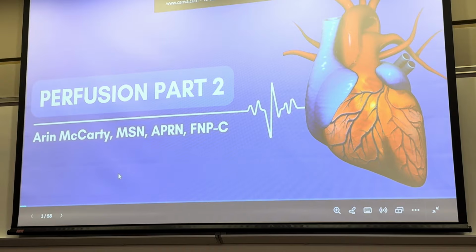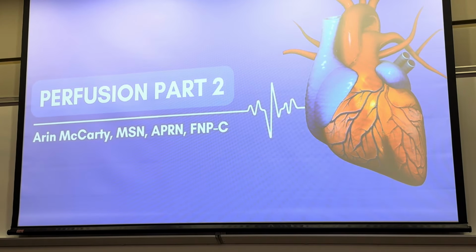So this is going to be review. You've seen this lecture before, but it's going to just hit the highlights, and I will post these EKG rhythms in Canvas probably tomorrow as well.